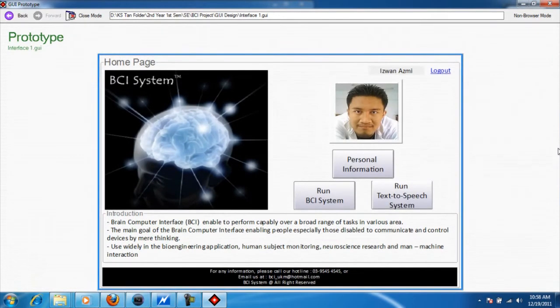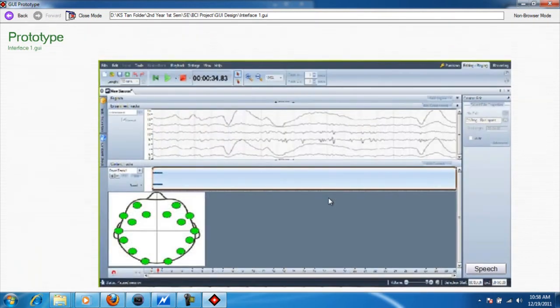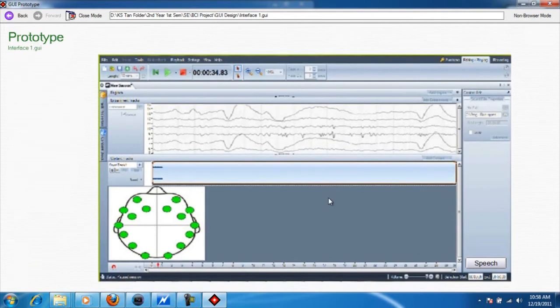The system allows you to access your personal information, run the BCI System, and run the text-to-speech system. In the BCI system, as you can see, the wave signal generated by the brain is recorded. Then, using the BCI system, it will process the wave signal and translate it into text.